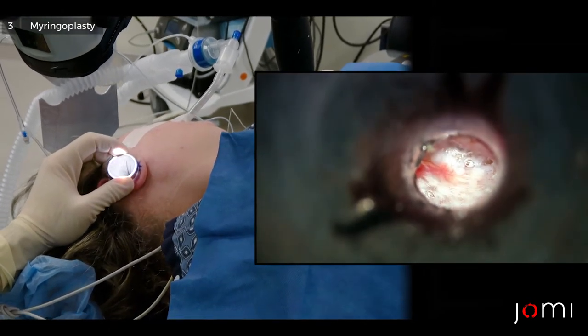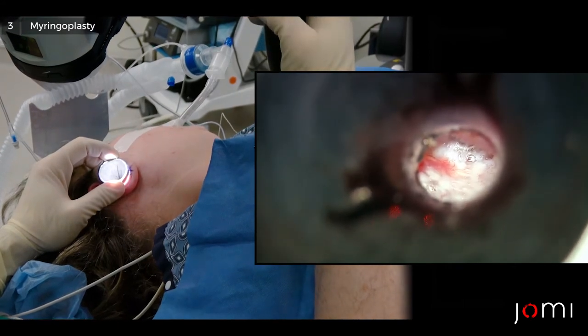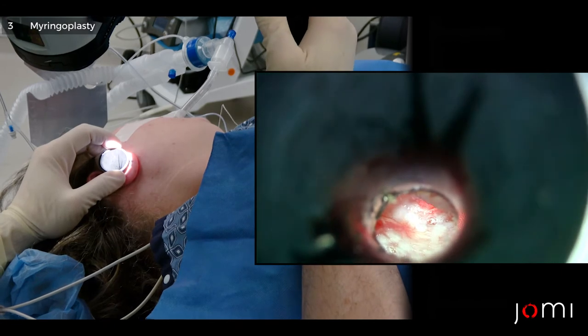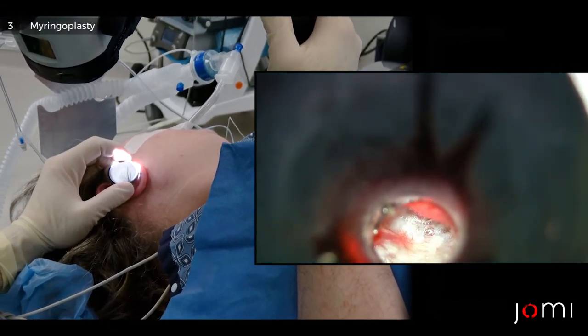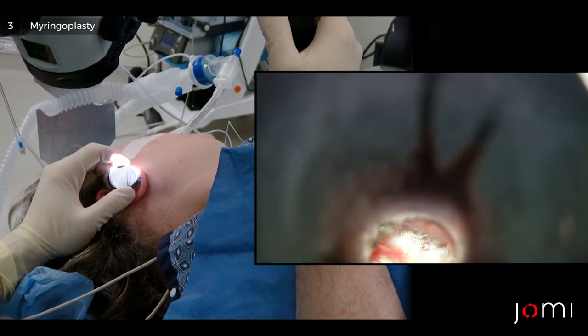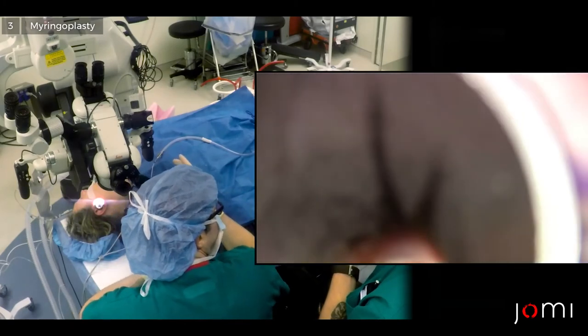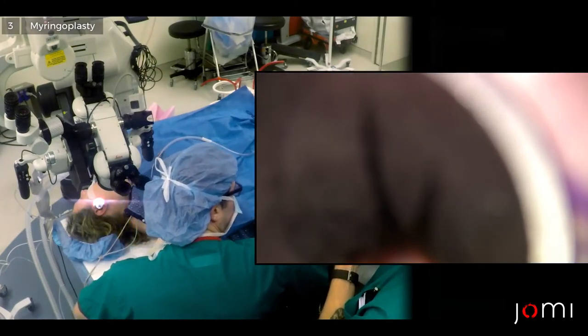That's pretty much it. Now we have an adequately tightened eardrum. That little bit of char there did not perforate it, but that's about where I'm going to put my tube. So now I'm going to put a T-tube in. We're done with the laser.